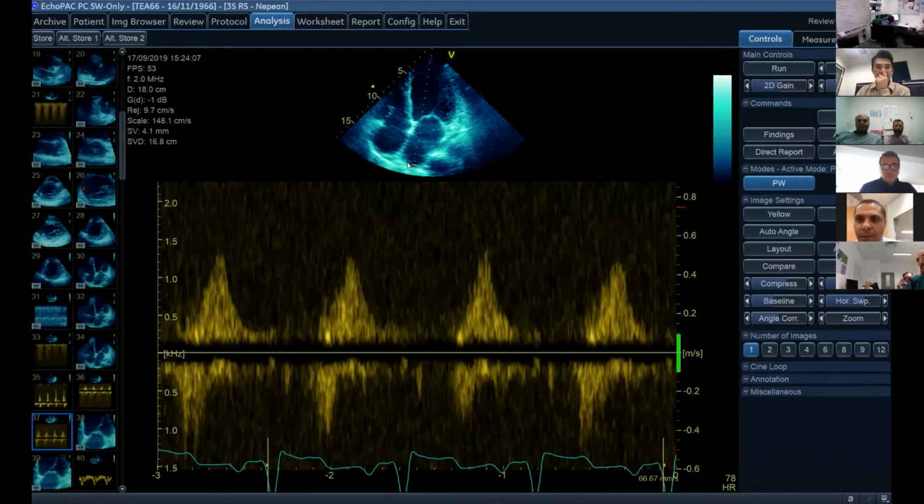Yeah, and which stage of the cardiac cycle? This is in the diastolic phase. So diastolic regurg, which denotes almost. Sorry, yes. No, Lewis, you're doing a great job. Lewis, tell us about this picture. So I'll let Lewis explain what this picture is and why he took it and what's abnormal about it.